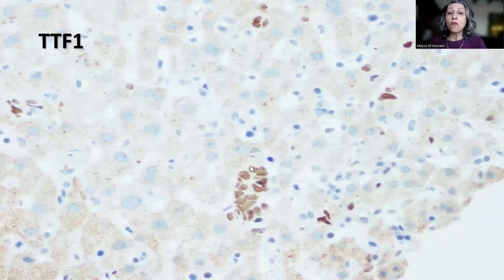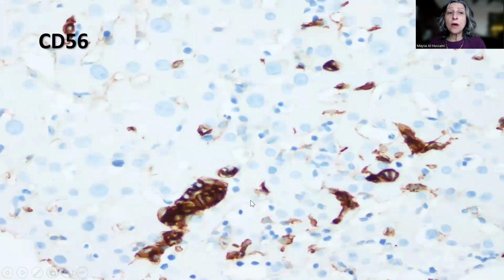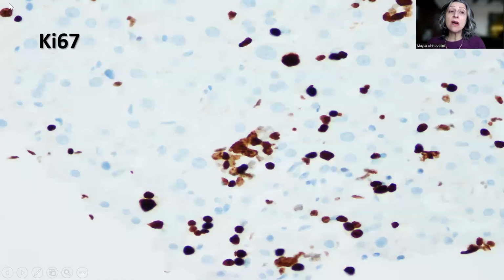And this is TTF1 showing those small foci of positivity of metastatic small cell carcinoma, as was the synaptophysin, with some larger groups of tumor cells and some individual tumor cells showing positivity. The CD56 again highlights the positive small and larger, but definitely not that large, metastatic foci, and the Ki67 was also positive.